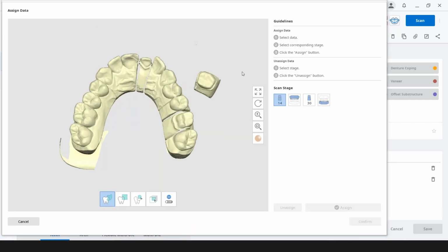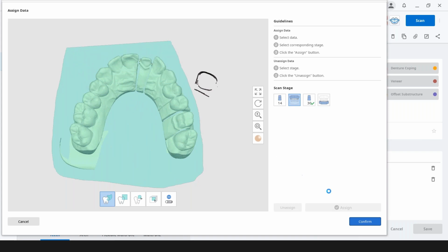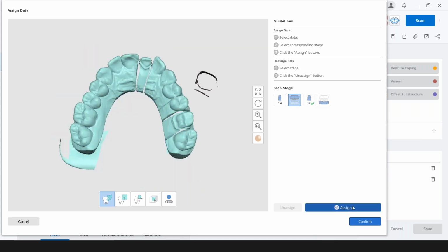Okay, so I'm going to be on number 30. I want to outline that quickly and assign it. And then this is the upper model. Now remember, they're opposites. So I'm going to go to the upper model. You just select the whole model and assign it? Yep, and then assign it.